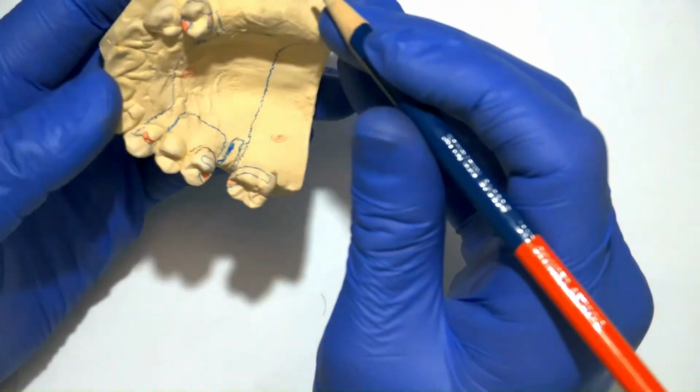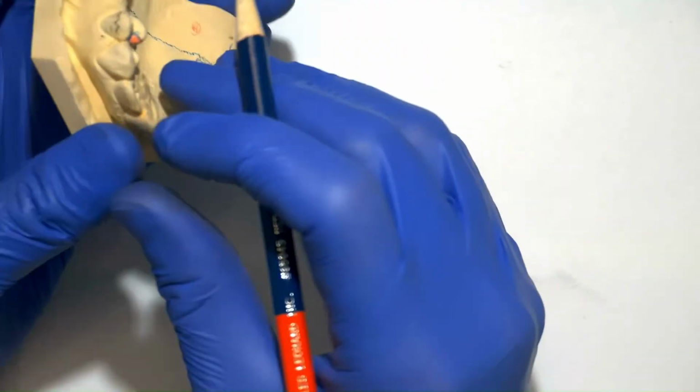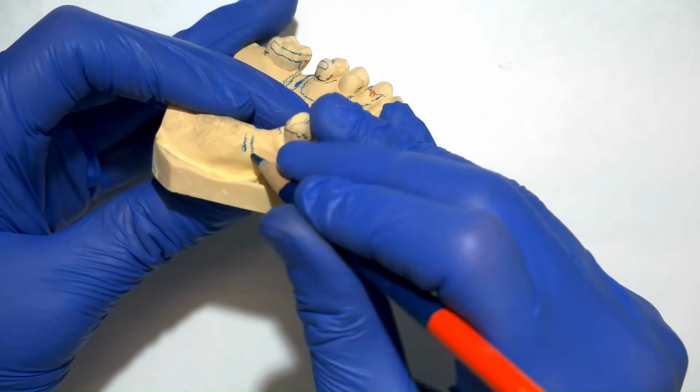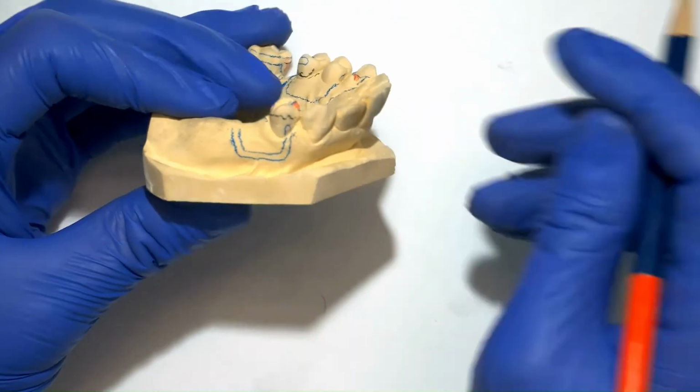Now we can start the eye-bar. The tip is drawn at the undercut. Then we're going to try to visualize skipping one tooth space and draw the origin of the eye-bar clasp. Then we're going to connect the tip with the origin to finish off the shape of the clasp.